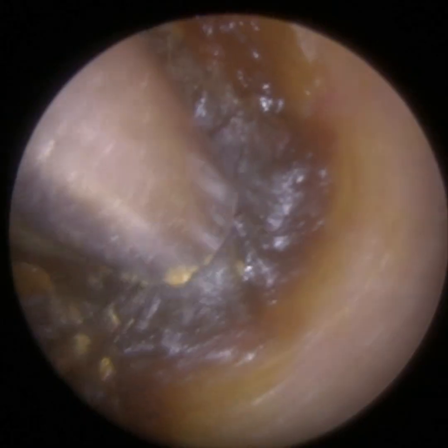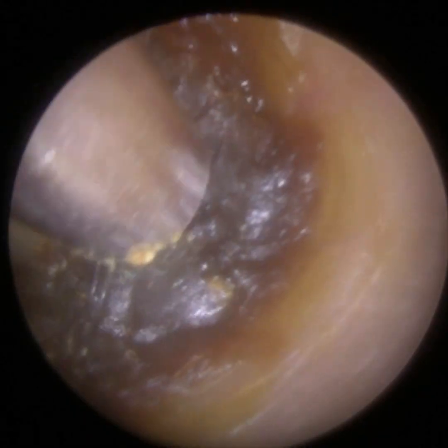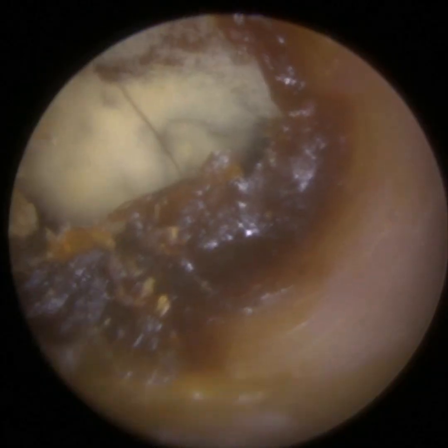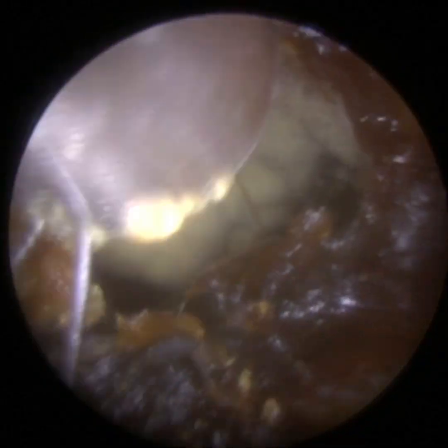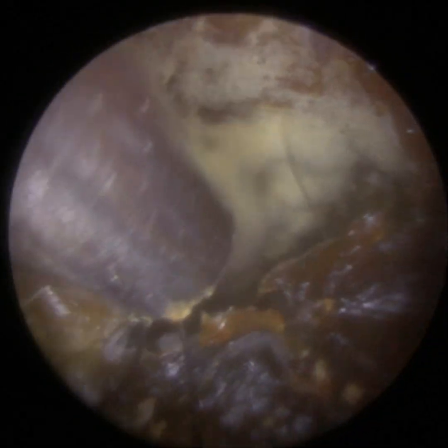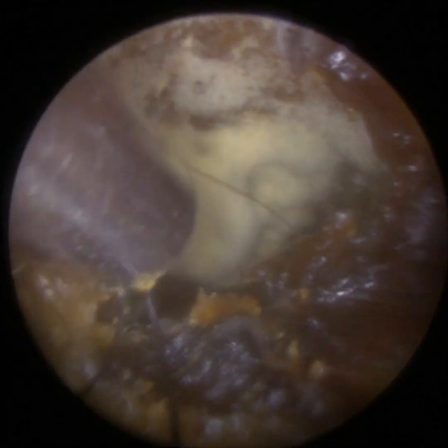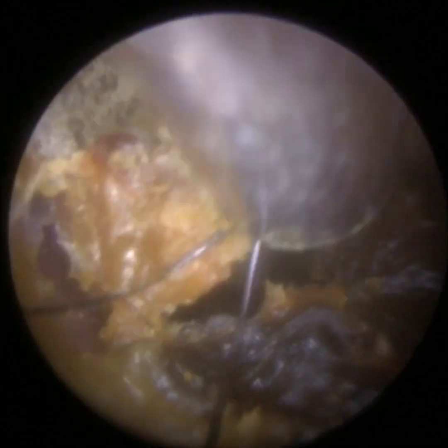And what I'm trying to do, this is really deep in the canal, is just trying to lift this off the canal wall. Because of the cotton bud, it has really impacted. So I'm just going onto the anterior canal wall now. And you can see those spores, like cotton wool, and it's attached itself to the skin.